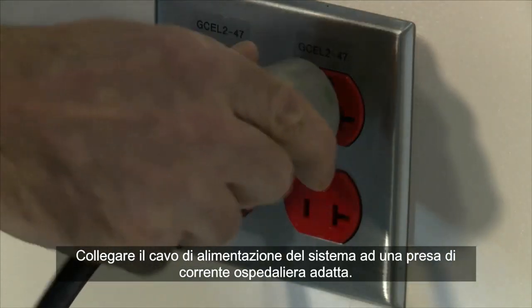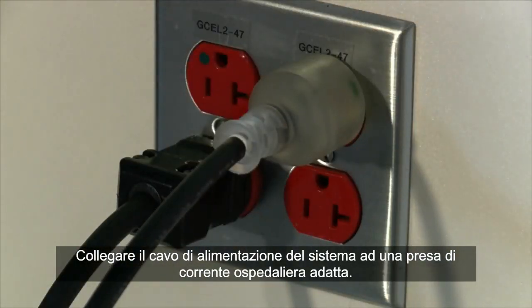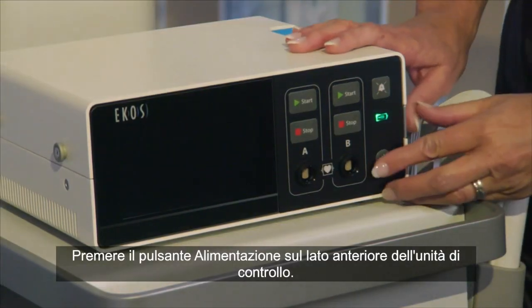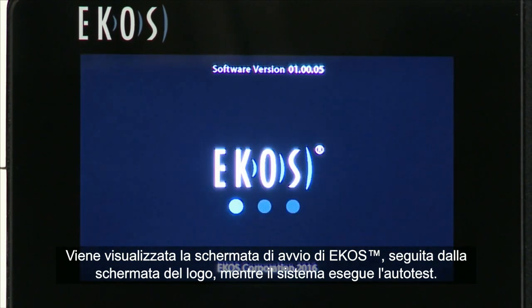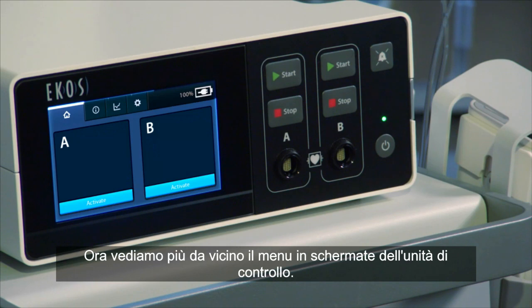Connect the power cord of the system to an appropriate hospital-grade outlet. Press the power button on the front of the control unit. The EKOS boot screen, followed by the logo screen, displays as the system performs a self-test. Now, let's take a closer look at the control unit's tabbed menu.